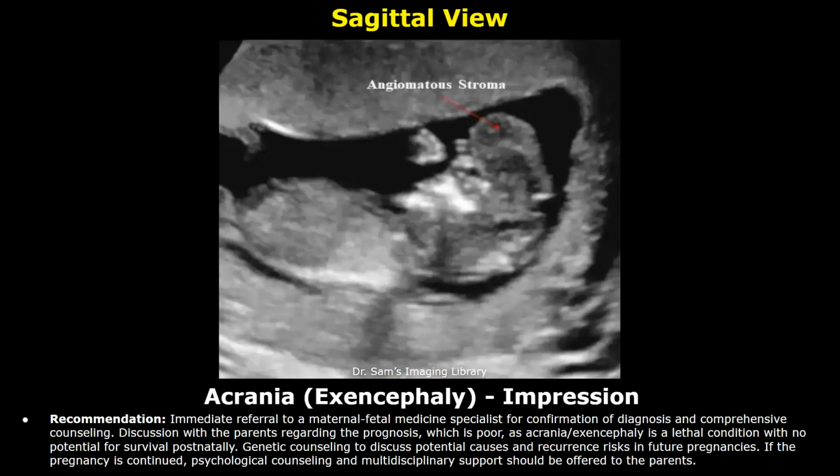Recommendation: immediate referral to a maternal fetal medicine specialist for confirmation of diagnosis and comprehensive counseling. Discussion with the parents regarding the prognosis, which is poor, as Acrania, Exencephaly is a lethal condition with no potential for survival postnatally.